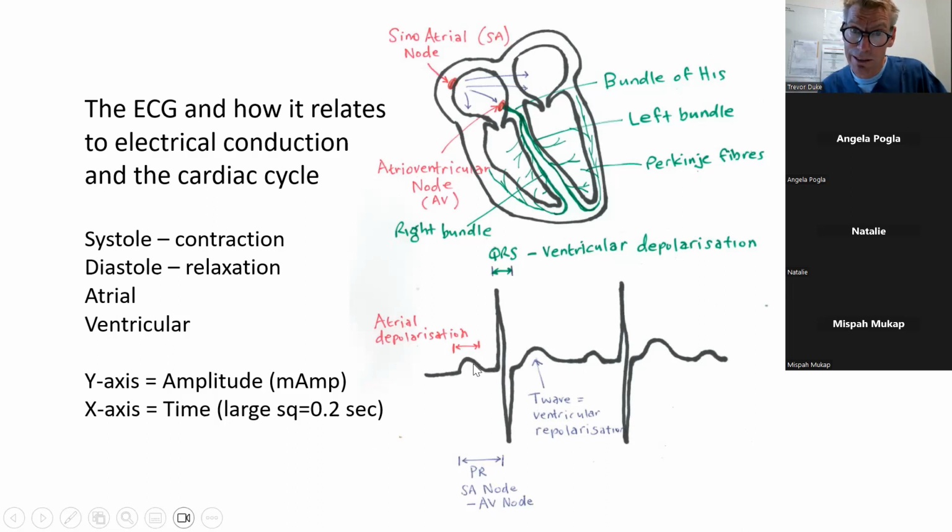And it's called P mitrale because if you've got mitral valve stenosis, then you'll have hypertrophy of the left atrium. Now, if you think about it, if a child's got mitral stenosis from rheumatic heart disease or congenital mitral stenosis, then the left atrium gets very thick, and that can prolong the P wave. If a patient has pulmonary hypertension for whatever reason, and it's chronic pulmonary hypertension, then their right atrium will be very thick, and then you'll have P pulmonale.